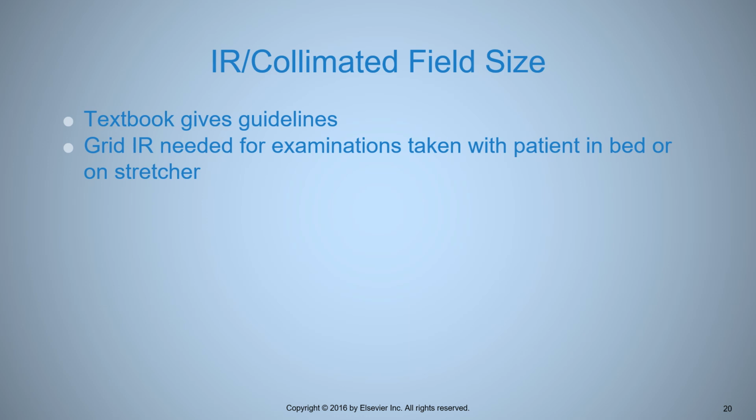If you're doing trauma, you might want to open up a little bit bigger. Also, in the digital age, digital radiography in the mobile setting is equivalent quality now. So a lot of times the transfer is unnecessary, especially in a trauma situation. You can easily do a trauma hip series on the stretcher, and sometimes it's easier because the stretcher's on wheels, whereas the exam table is not.